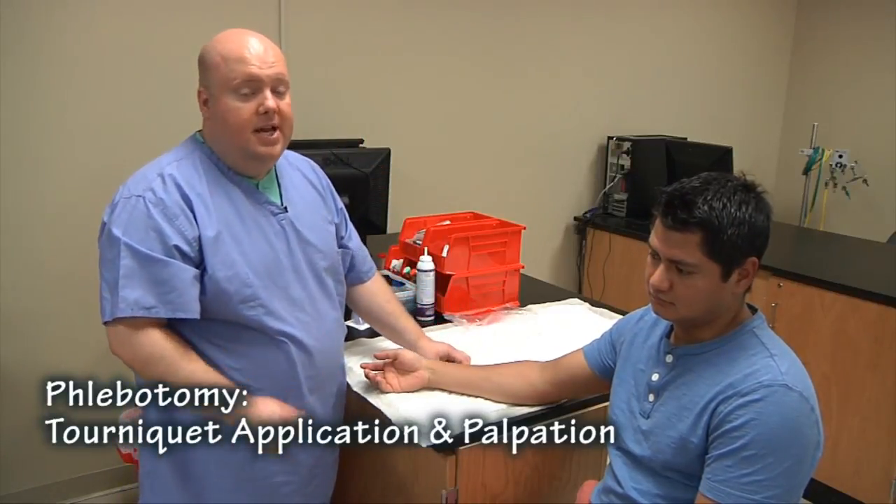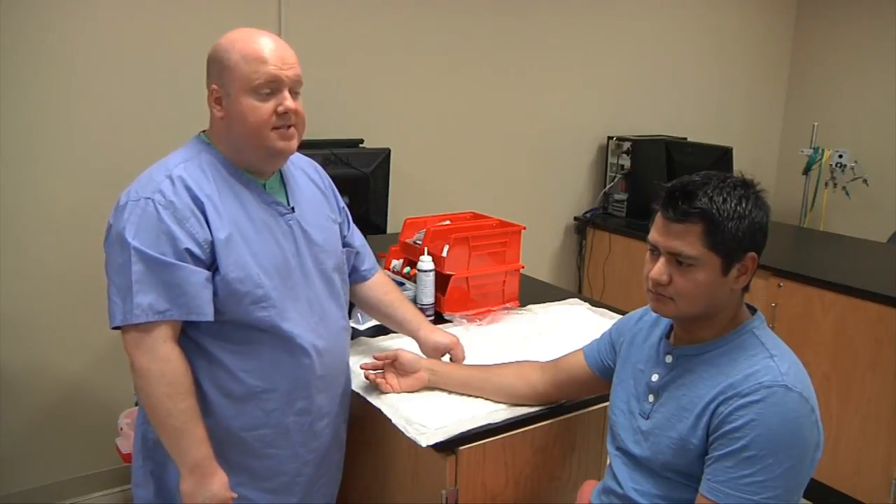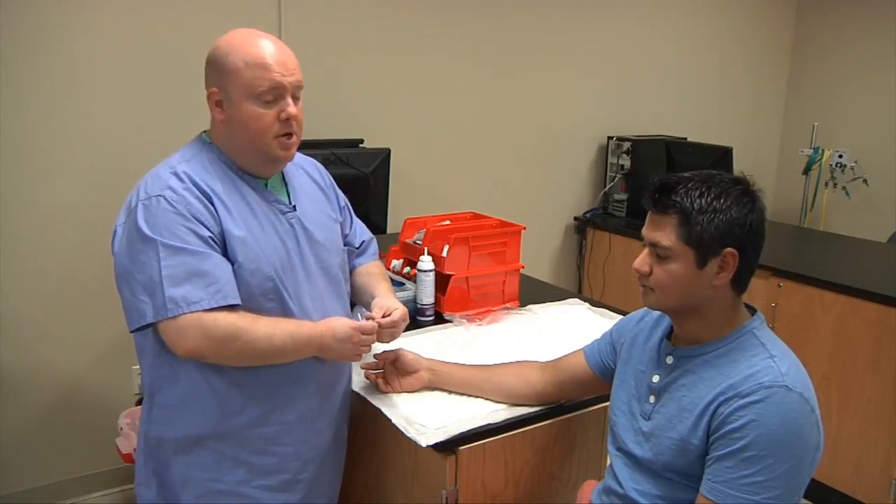Today we're going to learn how to do a tourniquet application, and we're also going to learn how to palpate for the veins that we will be accessing for phlebotomy.